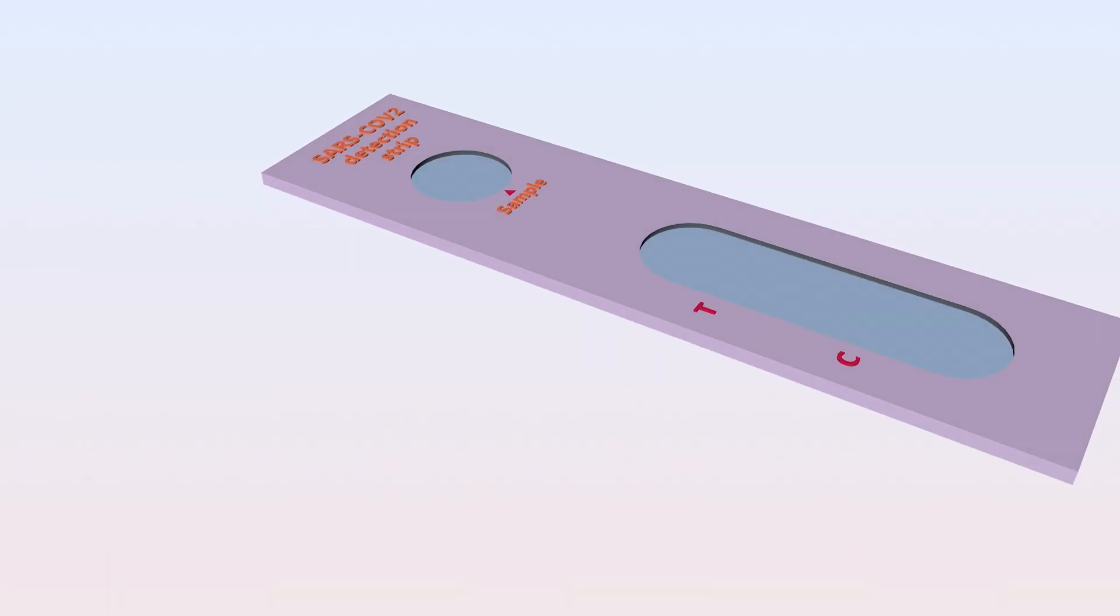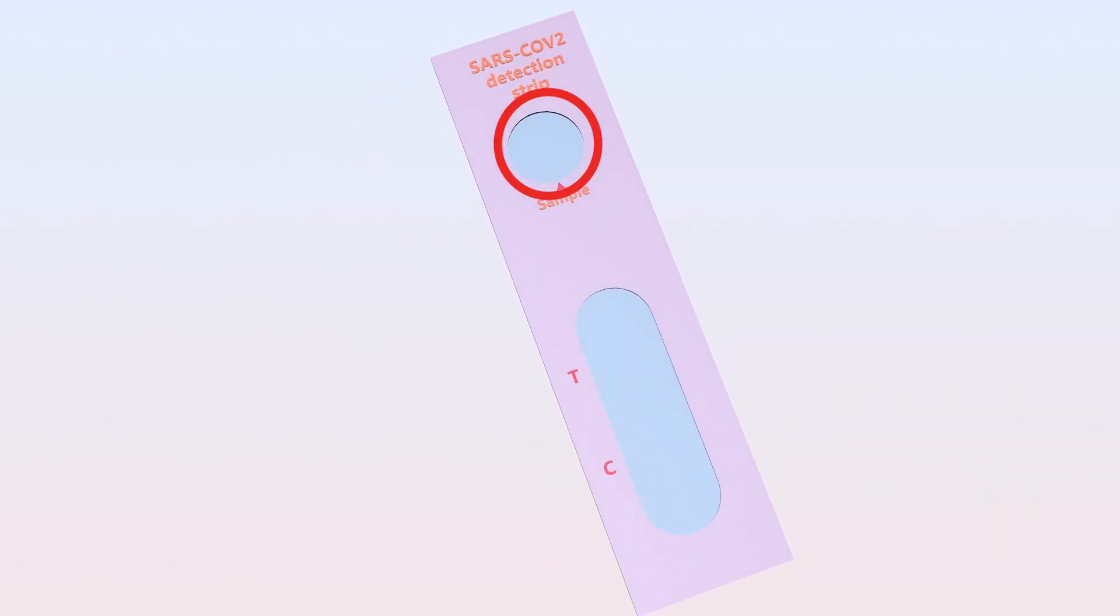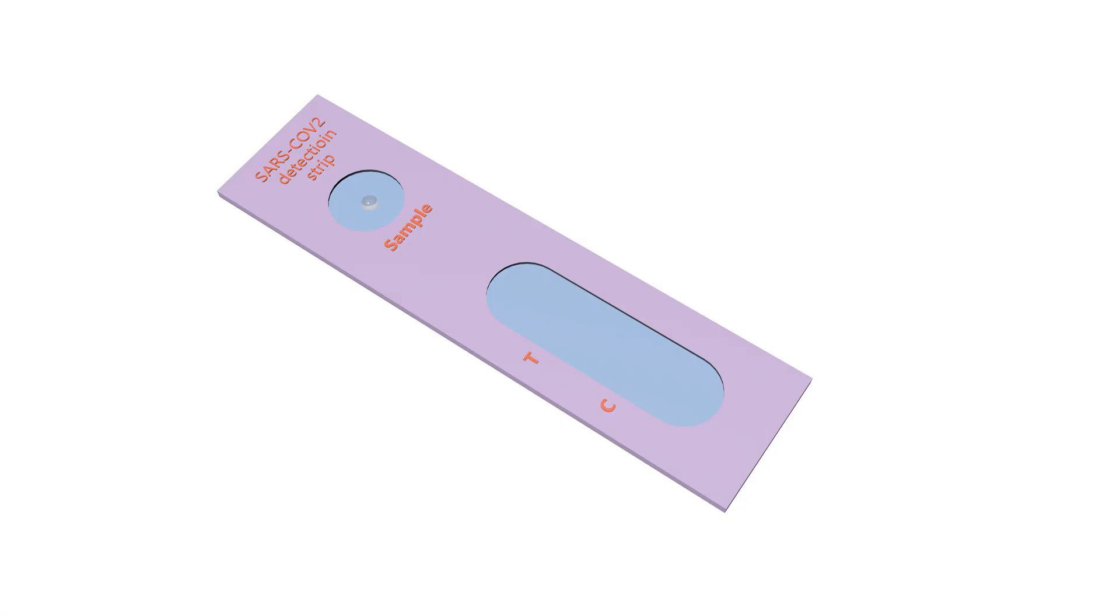This is a colloidal gold-based immunochromatographic test strip. You can see a sample loading area, which allows samples from pharyngeal swabs, nasal swabs, and alveolar lavage fluids to be loaded on the strip. You can also see the testing area marked with the letters T and C. T stands for test, and C stands for control.